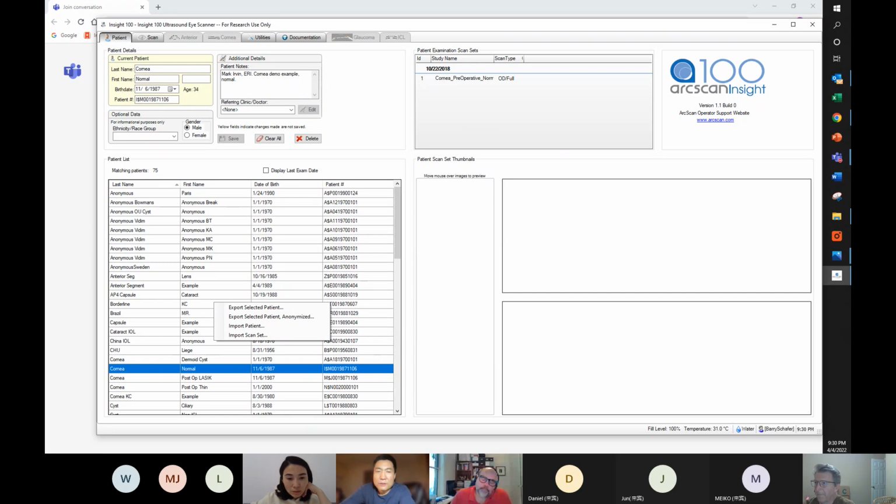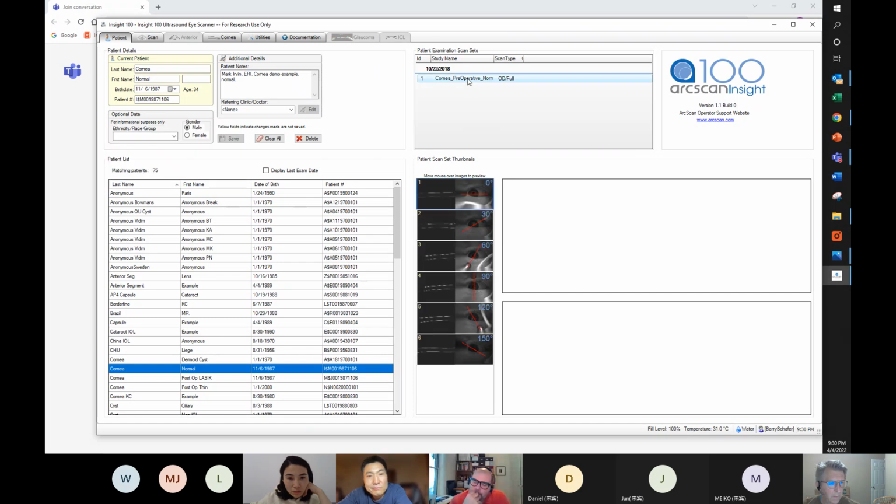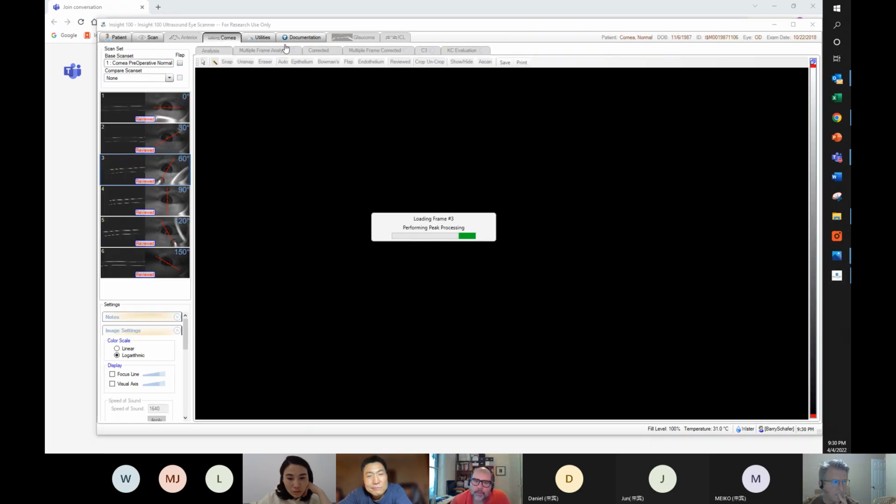I thought when the technician or doctor, I don't know who will operate the machine, does this imaging, they should tell the patients to completely open the eye and completely expose the cornea to the transducer. Yes, they should. But they may not be looking at the lines where the scans are.